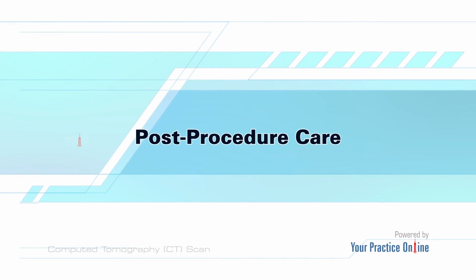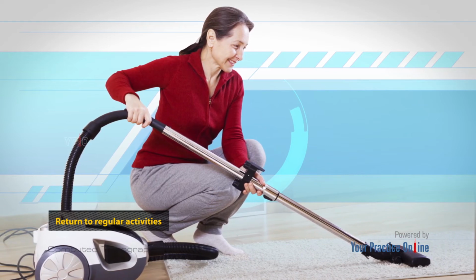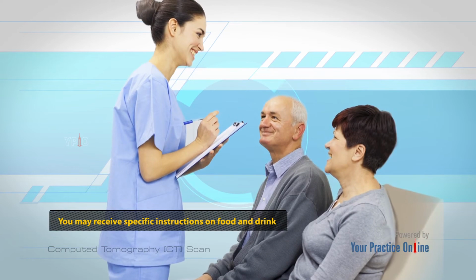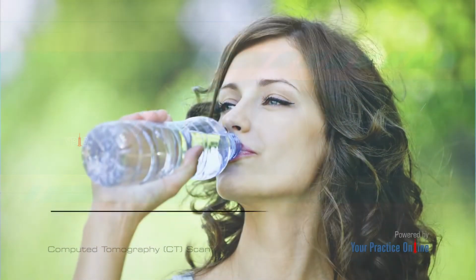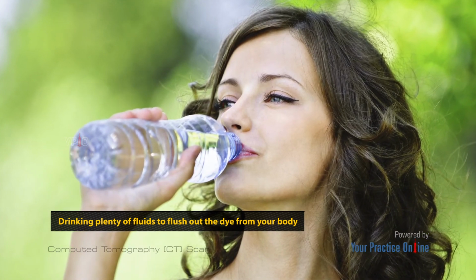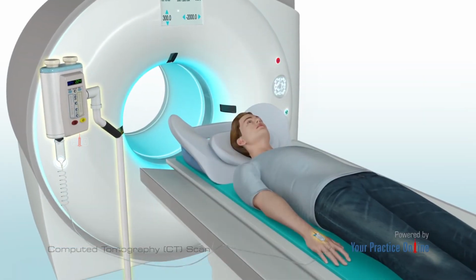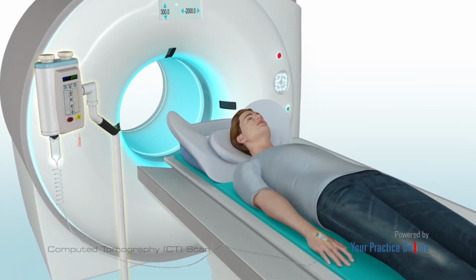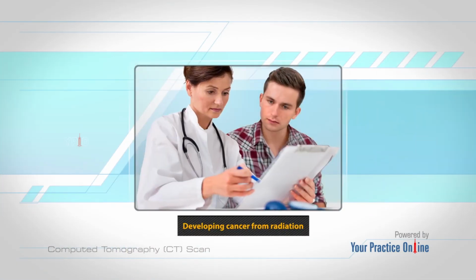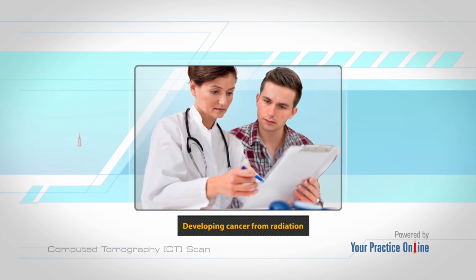Post-procedure care. You are allowed to return to your regular activities once you are done with the CT scan. You may receive specific instructions on food and drink when a contrast dye is used during the test procedure, such as drinking plenty of fluids to flush out the dye from your body. Risks and complications. Side effects from CT scans are very rare and may include allergic reaction or kidney problems due to the contrast dye. Risk of developing cancer from radiation is rare, but increases with multiple scans.